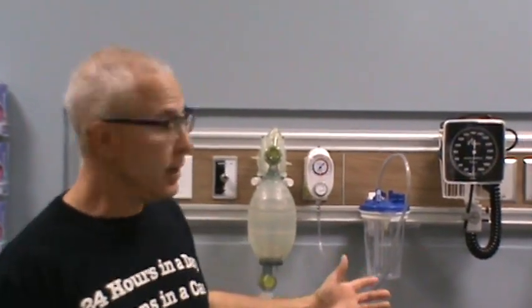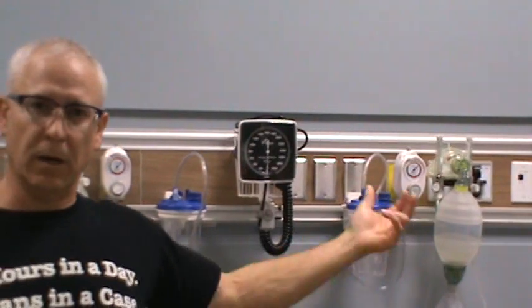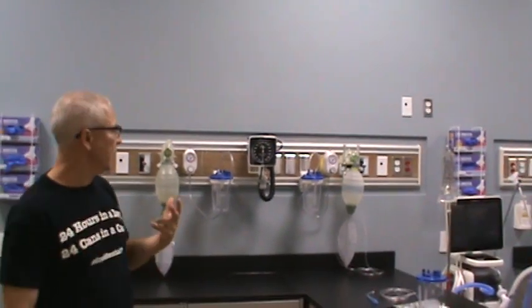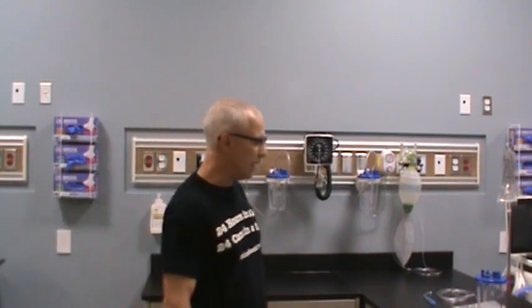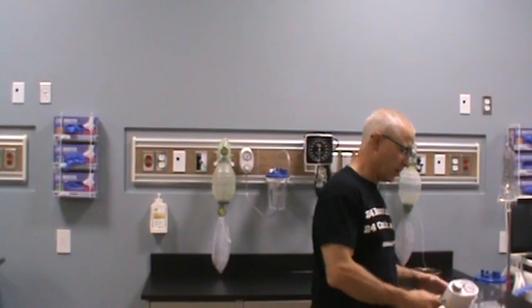My name is George, and I'm a registered respiratory therapist. Let's take a look at the regulators. You're probably seeing regulator A and regulator B — there are two of them on our station outlets behind the patient's bedside, and they probably look very, very similar. They are similar, but there are some slight differences between the two, and we're going to cover that. The first one I want to look at is a basic adjustable suction regulator.